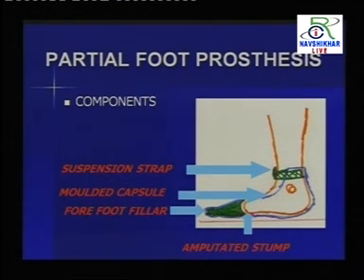In the normal shoe, the gap we are filling with some synthetic material, rubber material, molded. These materials are normally used and are light in weight. Without a shoe they can also walk barefoot at home, but when the patient needs a cosmetic point of view, because nowadays function is not enough, you have to provide cosmesis also. So cosmesis is more important. This is one method we have shown here: filling the normal shoes which are available in the market.